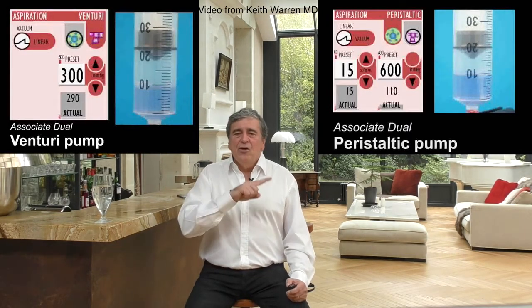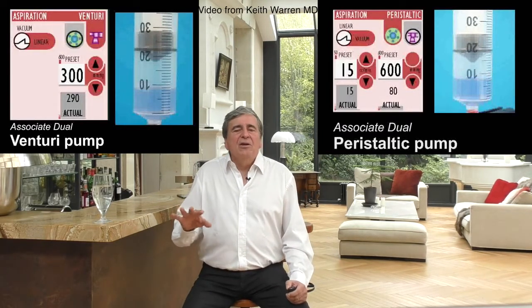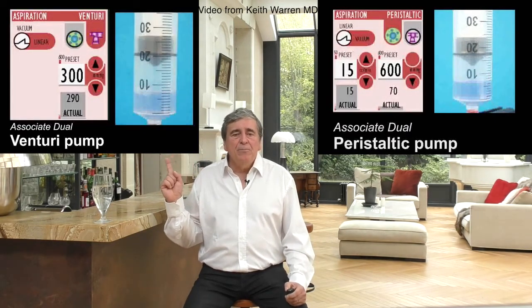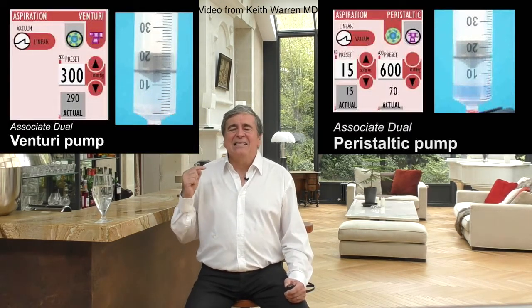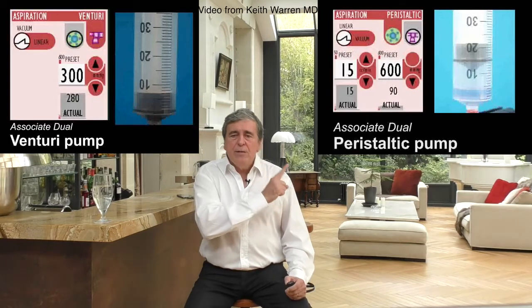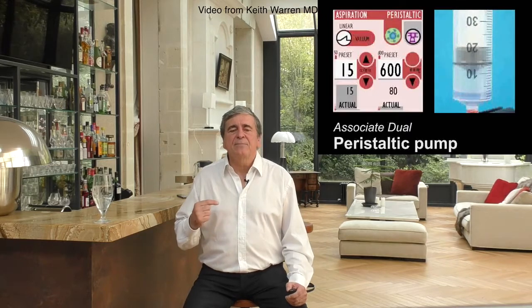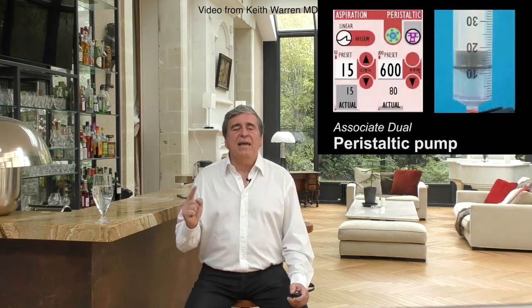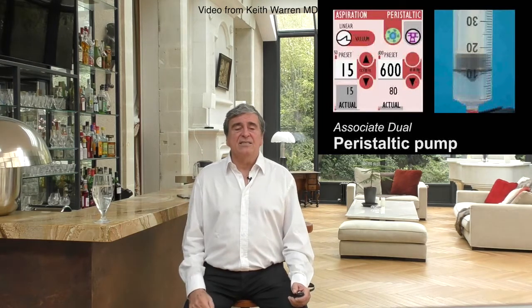At the beginning, the two pumps will suck the honey at about the same speed in about 40 seconds. Then, on the left side, when the Venturi pump passes through the water, the speed of aspiration accelerates and becomes uncontrollable in the air. On the contrary, on the right, the peristaltic pump will continue to regularly suck at the same speed in the water and even in the air, which explains why it is so precious in fluid-air and especially air-fluid exchanges.